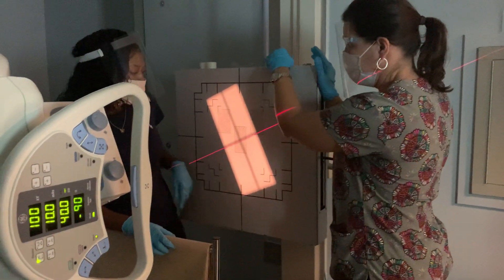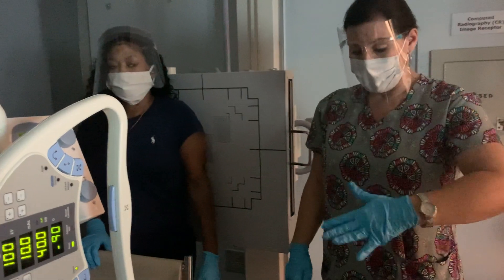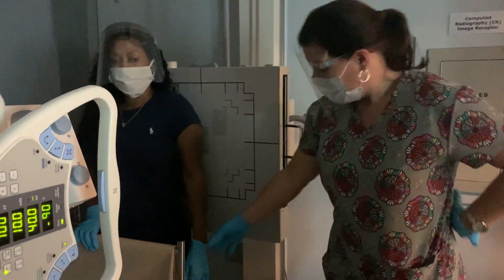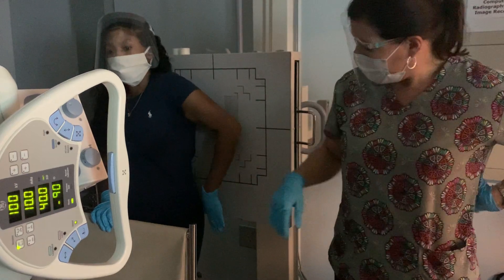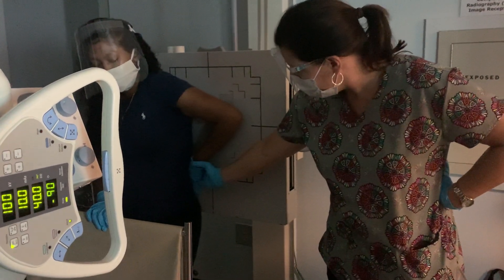We're going to put your right back up against there again. For this projection, to get a lateral, we take the patient's hand and we put the back of their hand up, bend your elbow, and put the back of your hand up against your back. Just kind of flatten it. There you go.